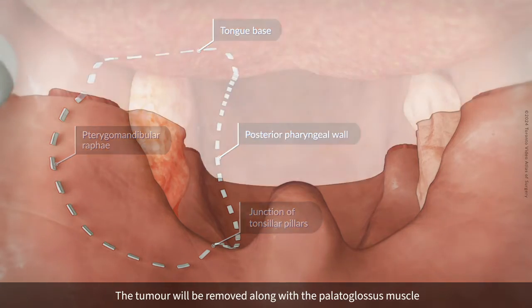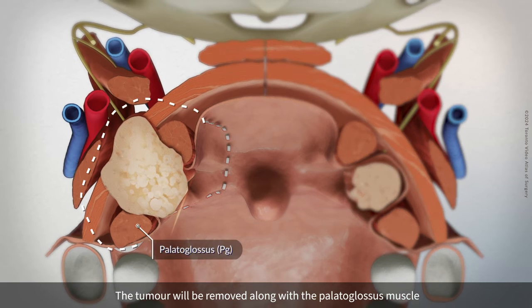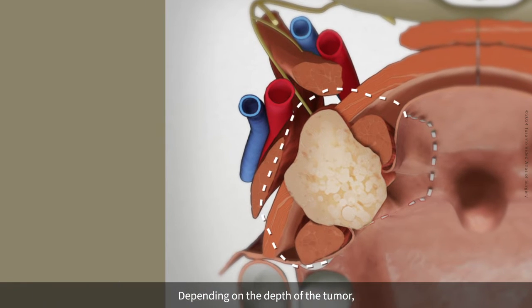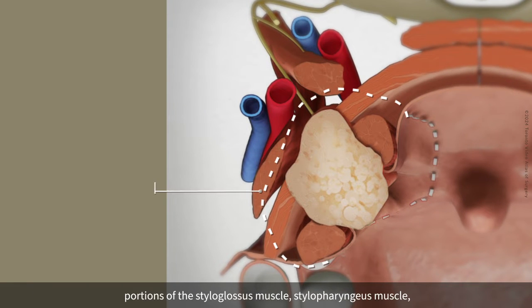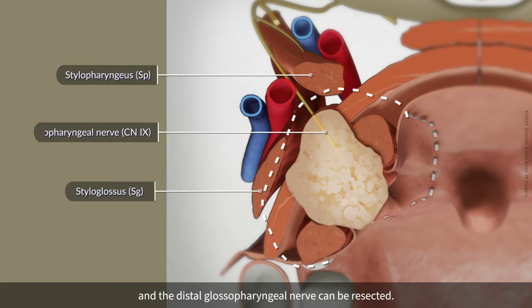The tumor will be removed along with the palatoglossus muscle, the palatopharyngeus muscle, and the superior constrictor muscle. Depending on the depth of the tumor, portions of the styloglossus muscle, stylopharyngeus muscle, and the distal glossopharyngeal nerve can also be resected.